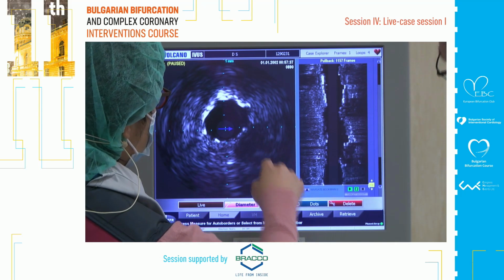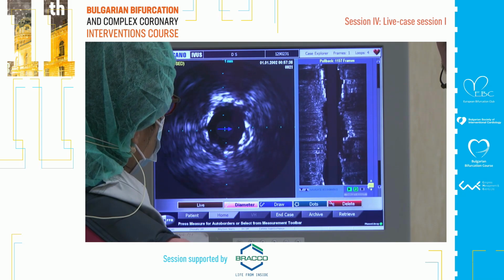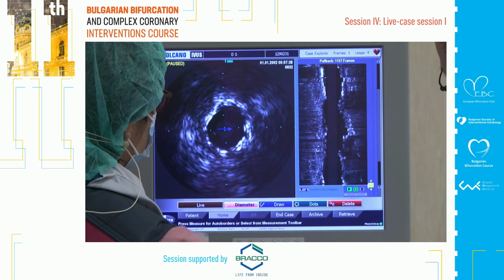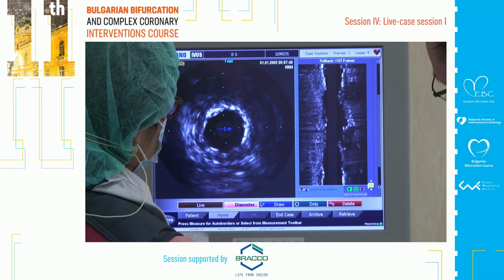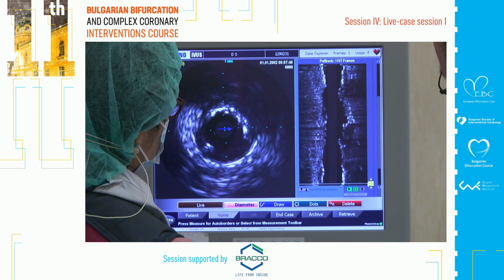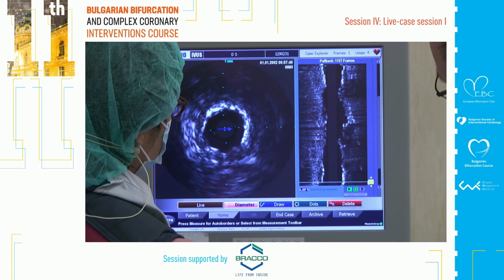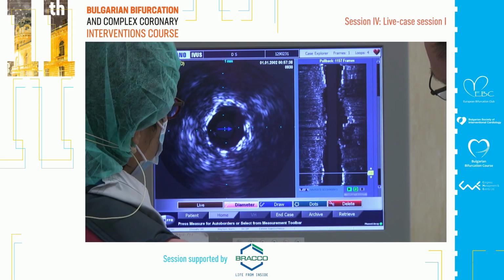This is a circumflex, which was slow. It's coming. I think you cross the stent. Nothing over the wire. Just one, and this is a stent. And actually, this is a left main, I guess. And so I think for a very, very short few millimeters you are in the left main. So I think you should open the circumflex portion.